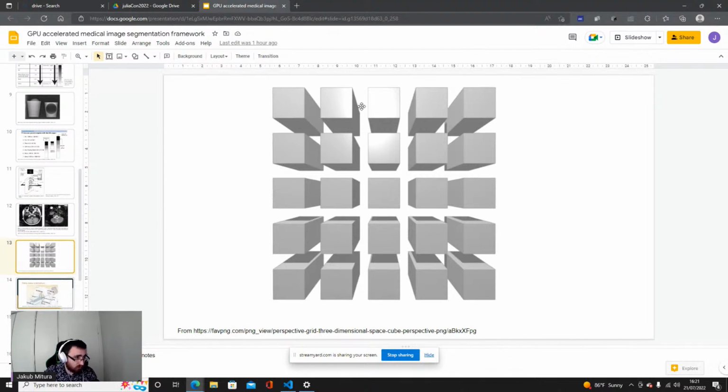Apart from this, each voxel, the voxel being this three-dimensional pixel, represents some physical phenomenon, a quantified physical phenomenon. The other thing is that it is also somewhere in physical space.